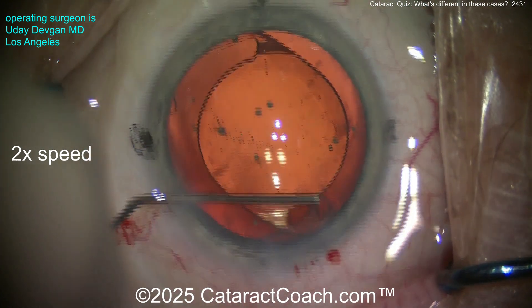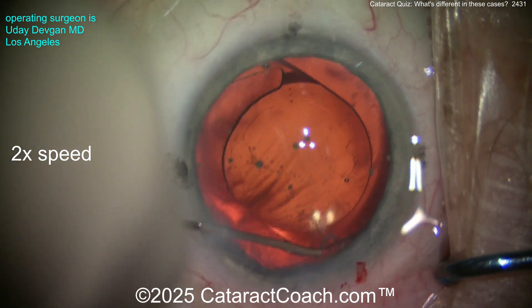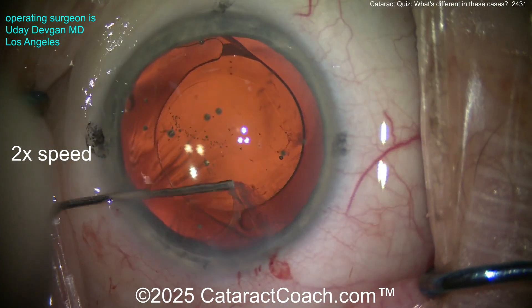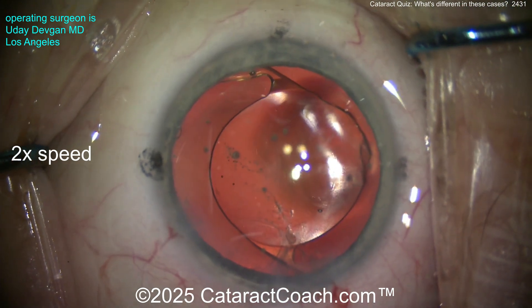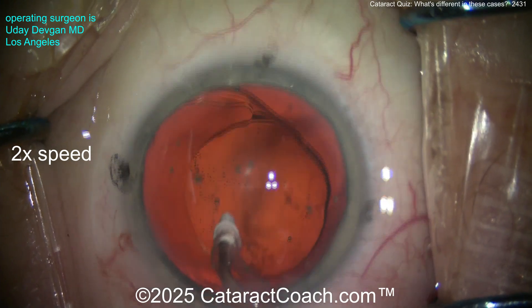I want to get that out — look, it's quite a bit of cortex. Using a 27-gauge cannula through the side port, just a little manual aspiration to be able to reach over and get that. Now if you had a bimanual setup, maybe that'd be easier, but this works very well. Look at that — removing all that cortex, loosing it up. Now I can go into the eye and it's very easily removed.